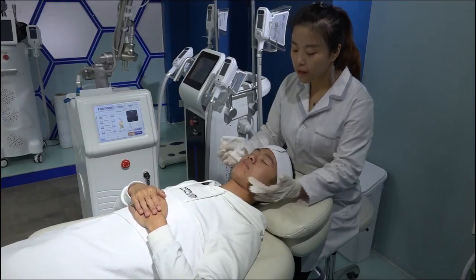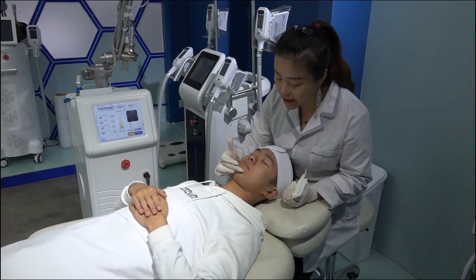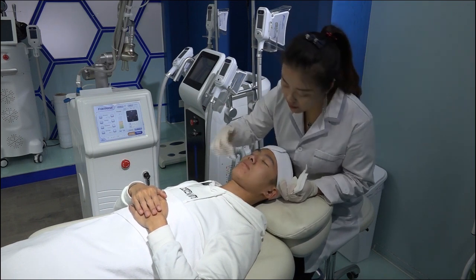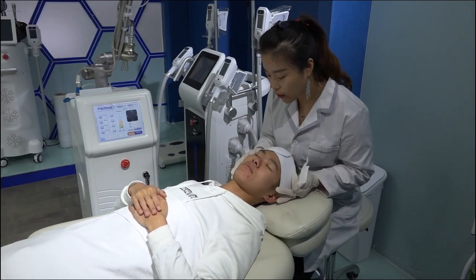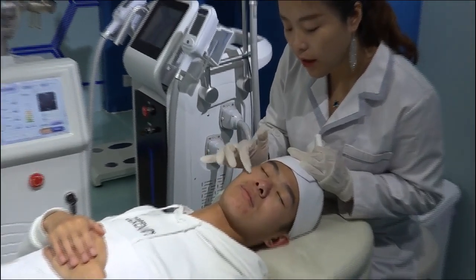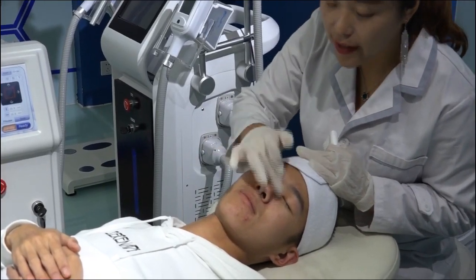Okay, now we see this model. Today we do the acne here, acne scar here, and also here. And also we do the nose. The nose has acne, and also we have the scar here and there. We will remove the scar, acne scar and acne on the nose here.